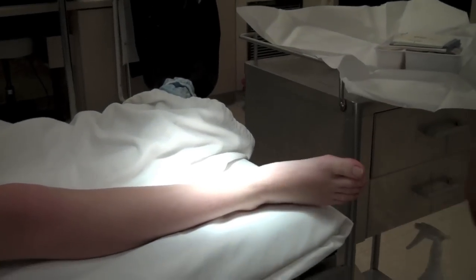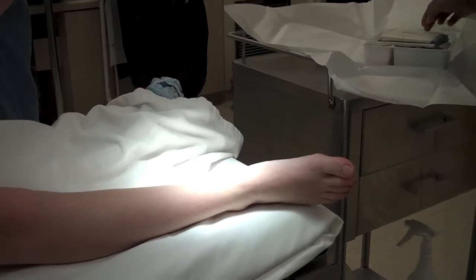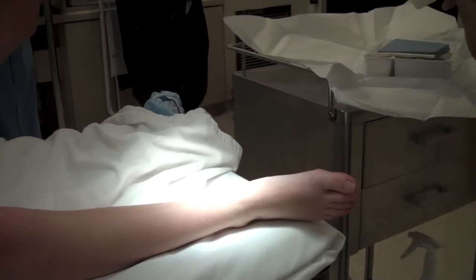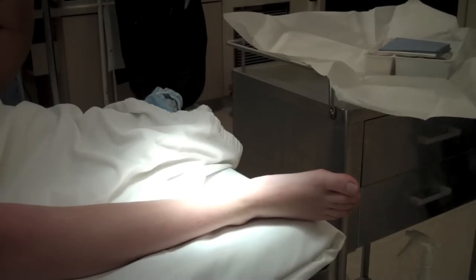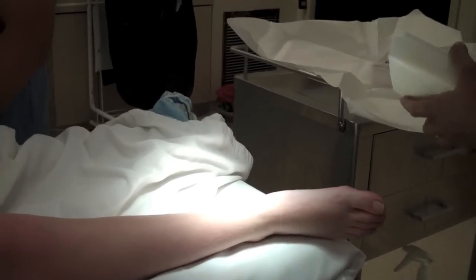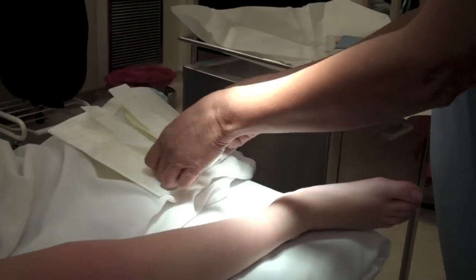We're going to prep the right foot. The reason for this is because we try to wash off all dirt, bacteria or microorganisms that might be on the skin. We can't make it sterile, but we're going to get it pretty clean.